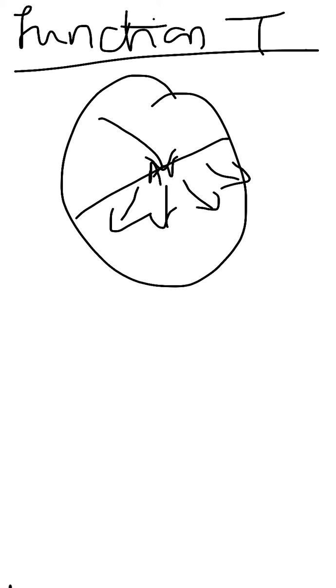So you find that there are excess impulses being given out, and this will lead to a shorter PR segment, and so on and so forth.